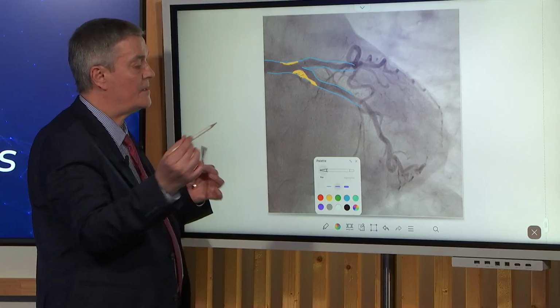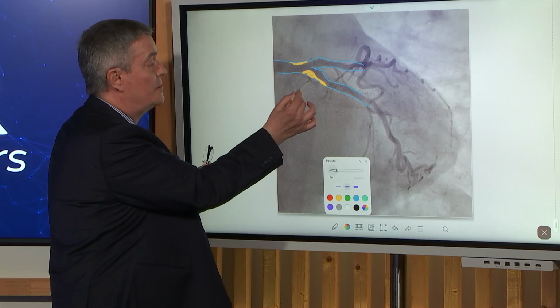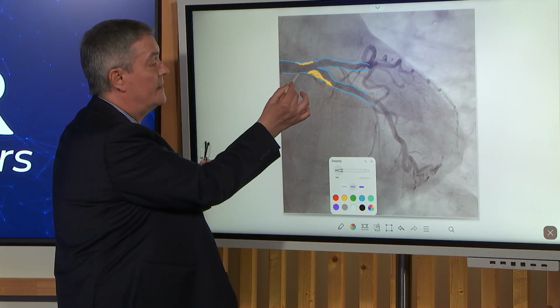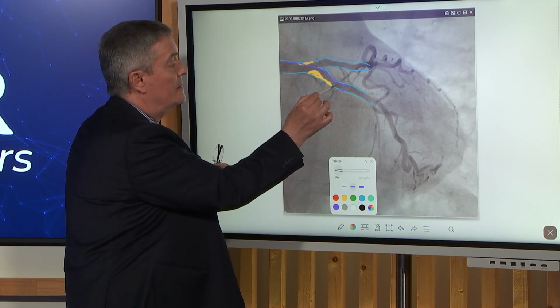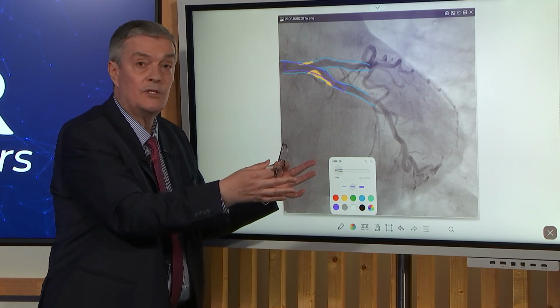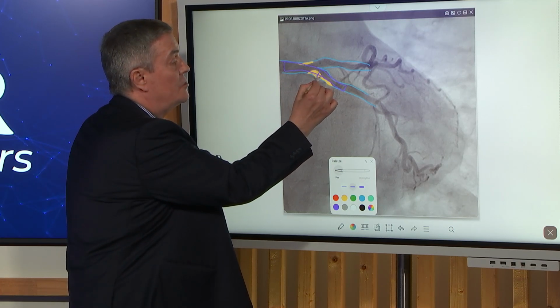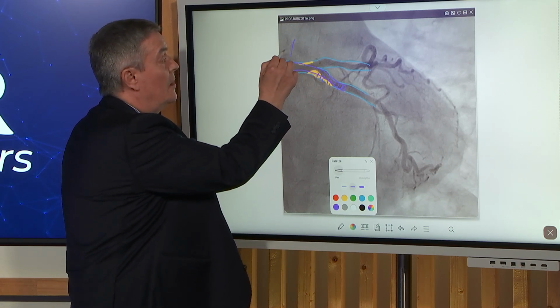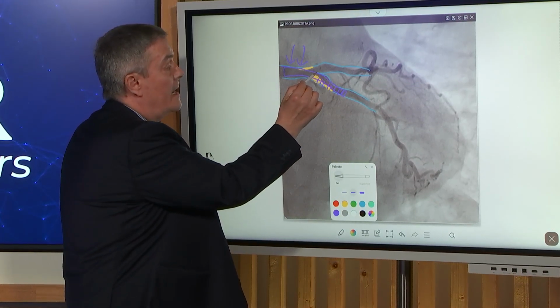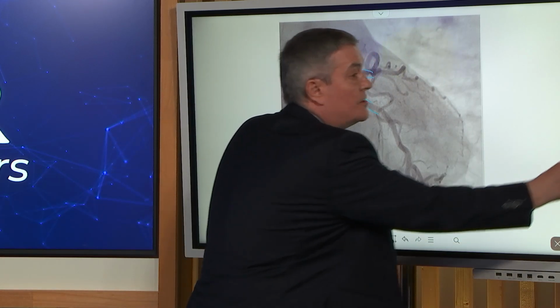Yeah, in my view, the question was related to ACS, and this is really an ACS patient. This is my interpretation, so I know that part of the plaque goes inside the left main as well. So crossover stenting from left main into the circ, sized according to imaging in this case, or sized based on angiography if you don't have imaging, and then optimization of the result, especially at the ostium of the circ, where the narrowing is, but also proximal optimization inside the left main, and kissing to remove struts from the ostium of the circ. Let's go back to Francesco and see what his strategy was.